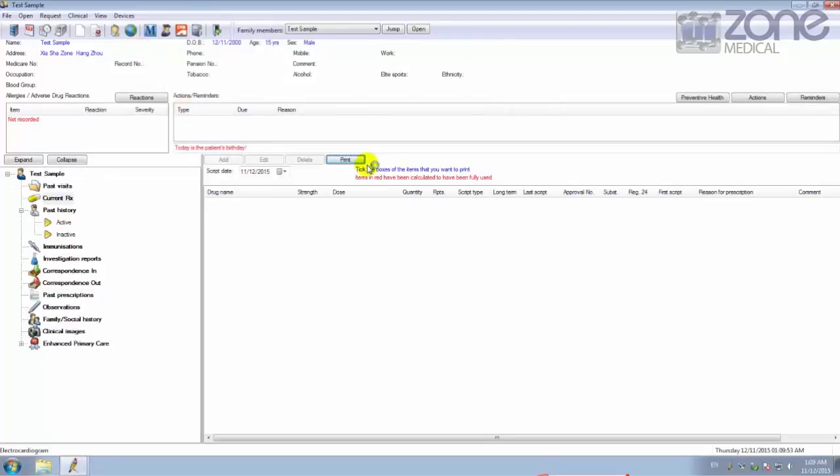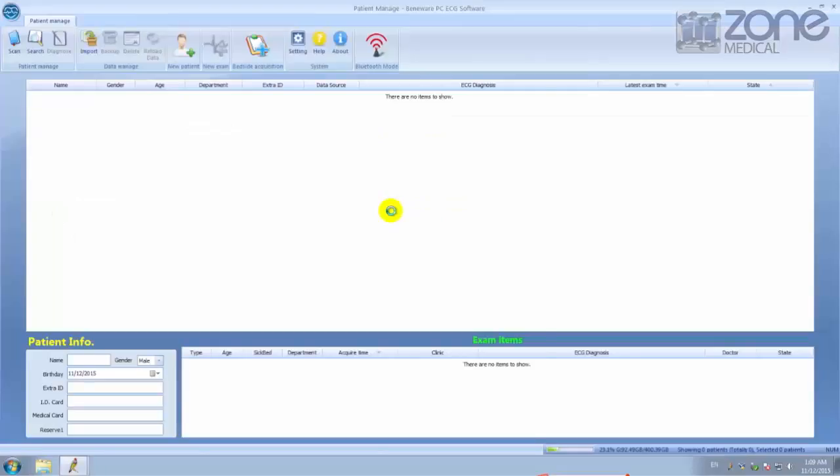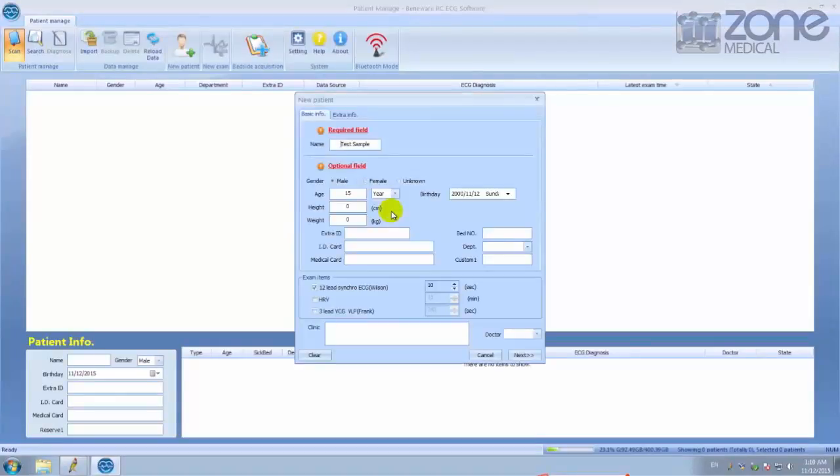This will open up an ECG test where you will be able to add extra details to give you a more successful test with the more information that you fill out.